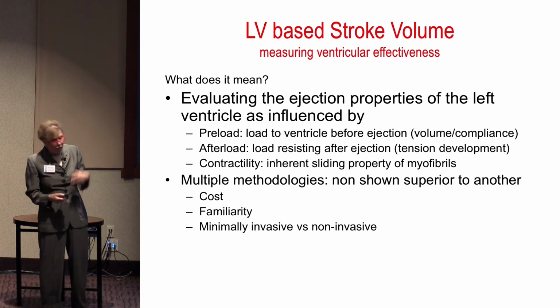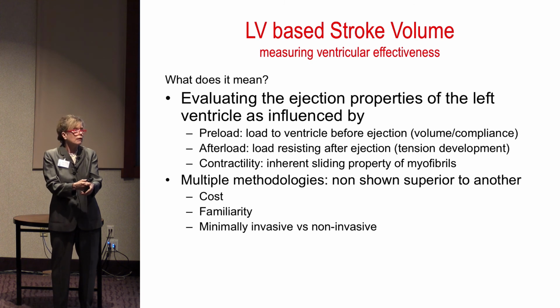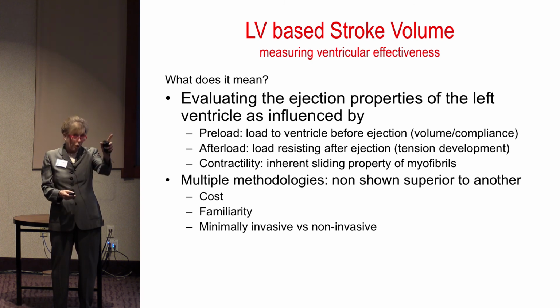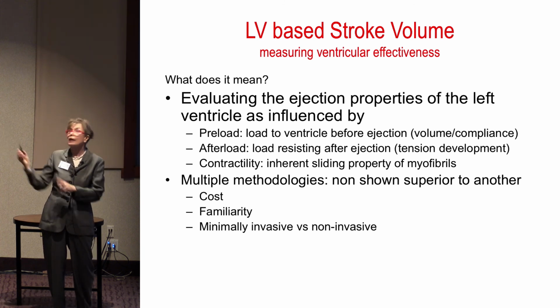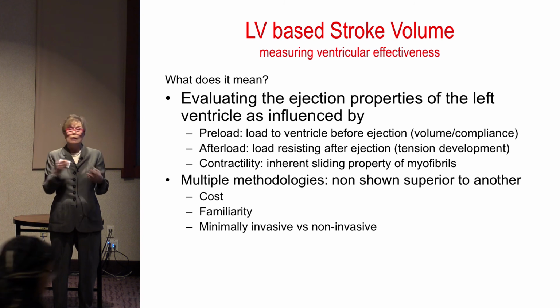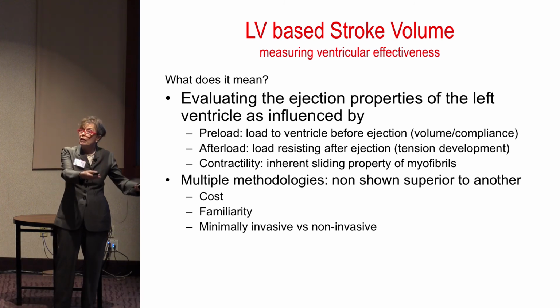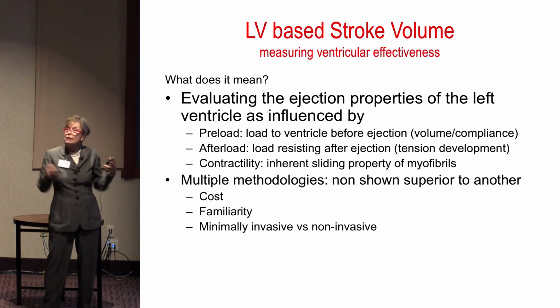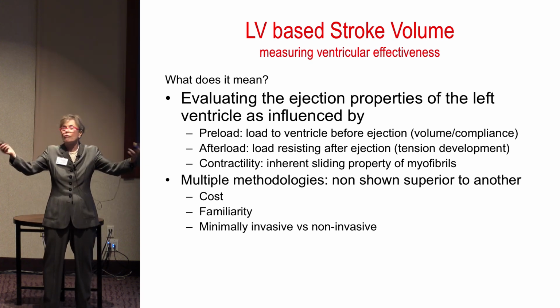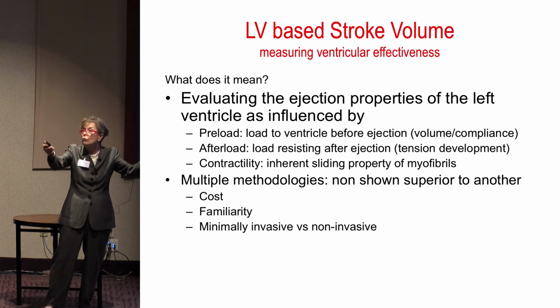So I like to start off first reminding you that anything that you're measuring in the artery or in the pulse is actually about LV stroke volume. With your PA catheter, remember you're looking at RV ejection, but with the arterial catheter or pulsatile signal, you're looking at LV ejection. If you're using electrodes on the chest, what you're looking at is thoracic volume, which is also fabulous. So I'm not having any preference of what way you look at it.